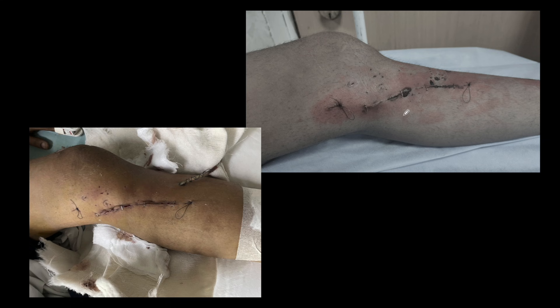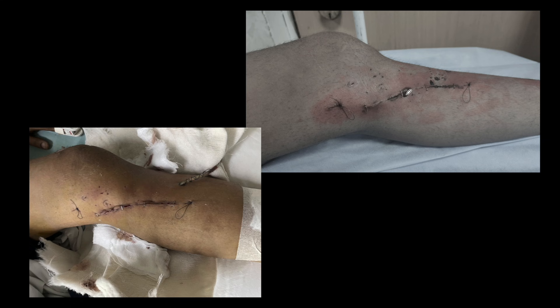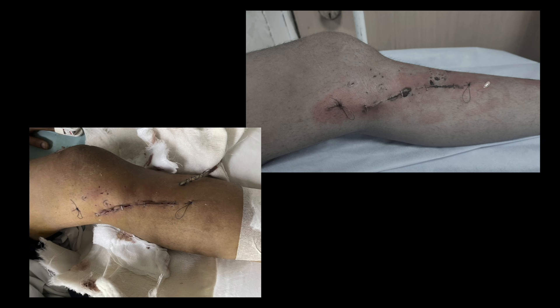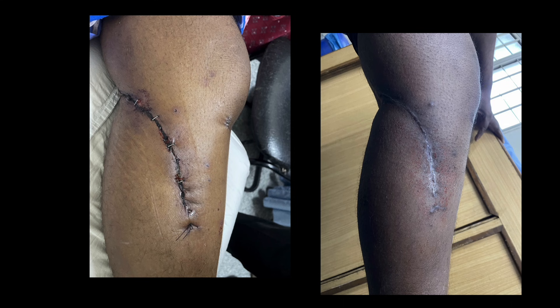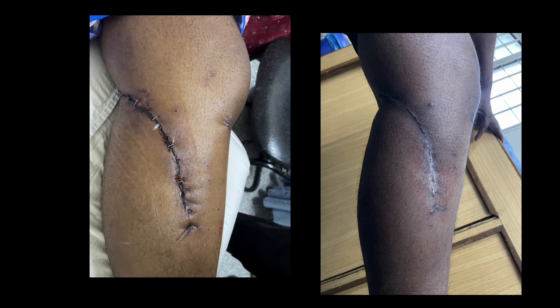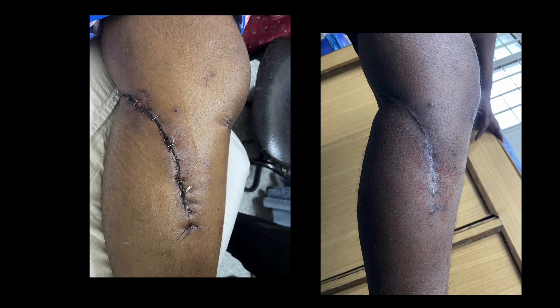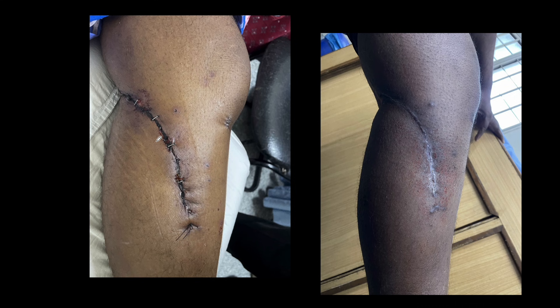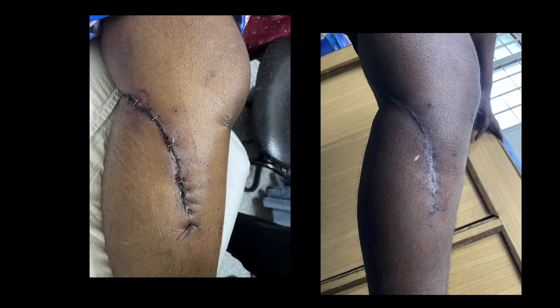Here is a similar case where subcuticular suture has been placed and wound healing is good with no necrosis — only some scab from an earlier blister. In another case of an uncontrolled diabetic patient, some necrosis occurred along the line but the remaining skin was healthy because there were no constrictions. A few staplers were added to prevent wound opening during early range of motion, and at two months follow-up the wound healed well.